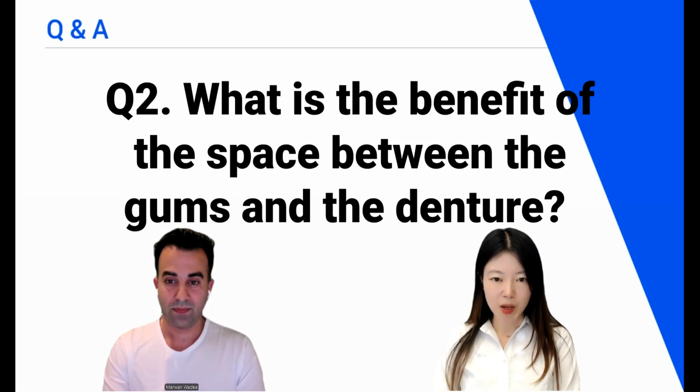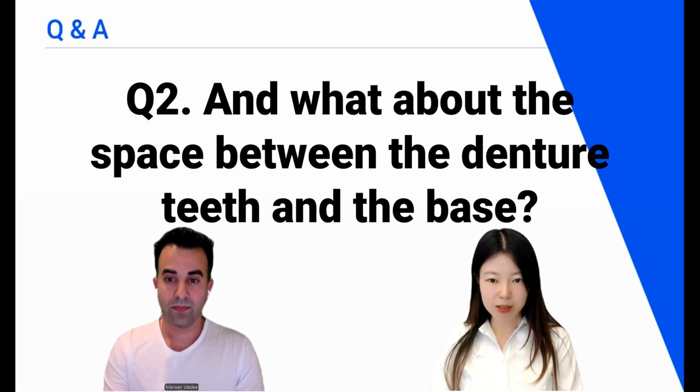Okay, next question. Question number 2. What is the benefit of the space between the gums and the denture? And what about the space between the denture teeth and the base? That's a good question. The space that I have demonstrated today in the webinar between the denture base and the gum, it's a relief for the pressure.